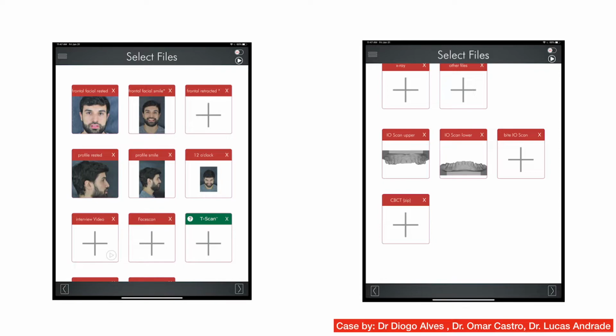The first option we gave him was an ortho treatment followed by cosmetic procedures. However, it wasn't what the patient wanted, as he needed a quick and affordable smile makeover due to the nature of his profession. So our second option was to offer him 10 minimally invasive composite veneers in the upper arch and adjustments in the lower anterior teeth, also using composite restorations, which would give him the same smile he helped us design in the DSDapp's first smile simulation. The patient approved the second treatment plan.